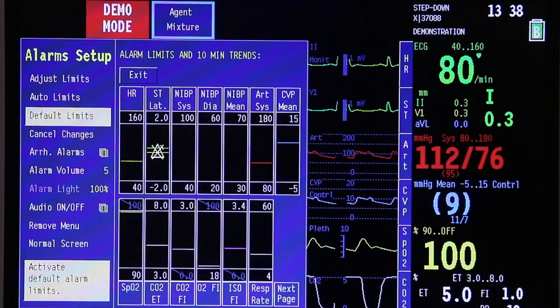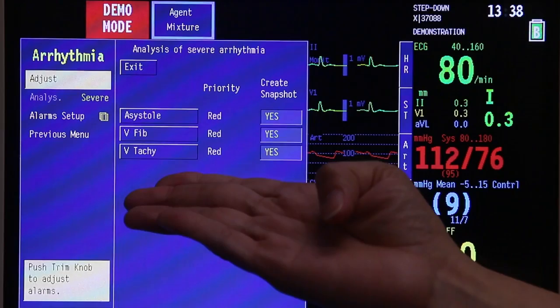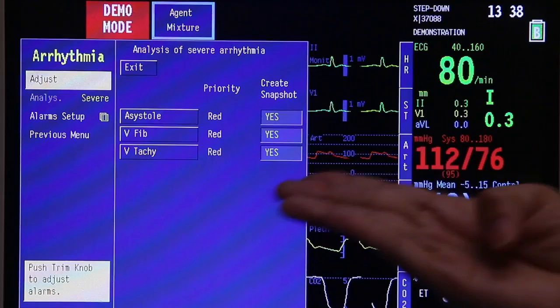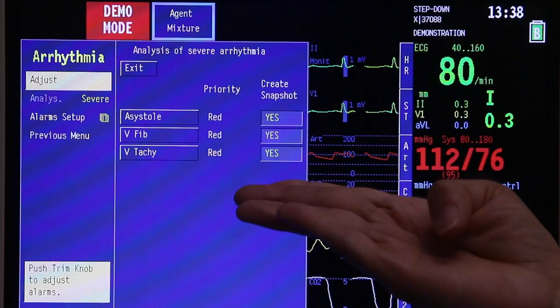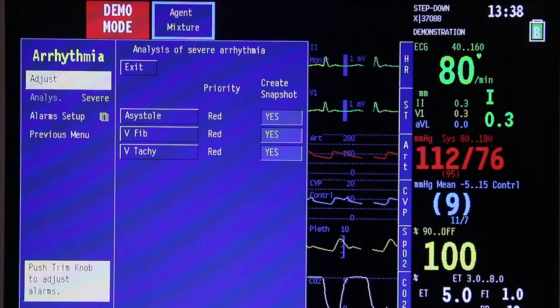Next, scroll down to arrhythmia alarms and press once. You will see that the lethal arrhythmias are all red — red priority means a high level of alarm. If you look at the right side, create snapshot is set to yes for all. This means that if it is an asystole, ventricular fibrillation, or ventricular tachycardia, the monitor will automatically create a snapshot for you.